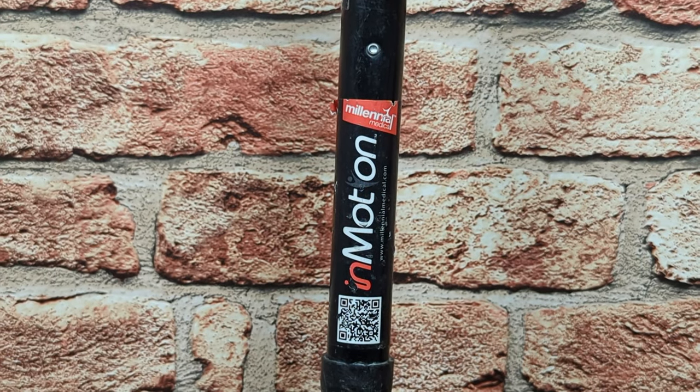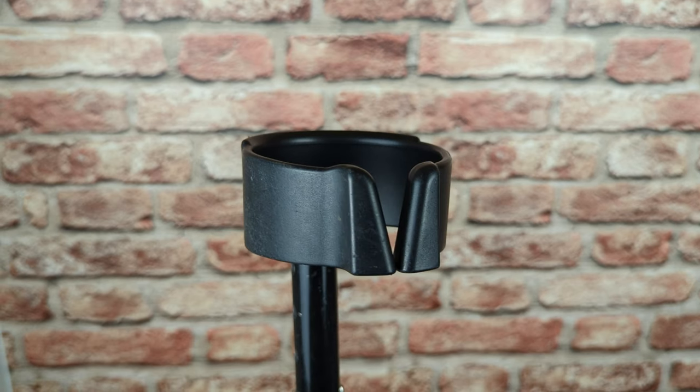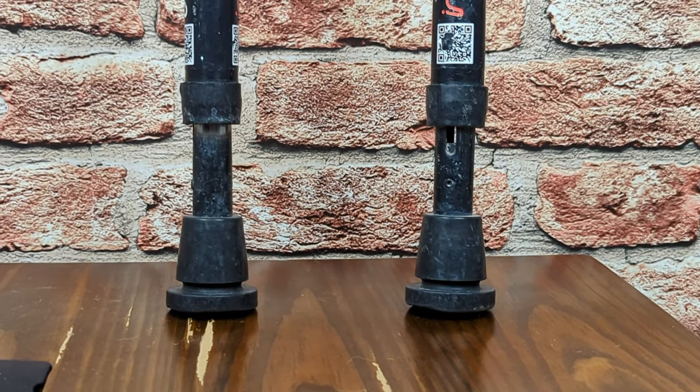Okay, now let's get to the reviews. If you only listen to one review today, let it be this first one. Millennial Medical's InMotion Pro forearm crutches have some really great features for a great price, and in my opinion are the biggest bang for your buck. They cost $130 for the pair, and they come with closed cuffs, ergonomic handles, and shocks — or spring assist, as they call it.